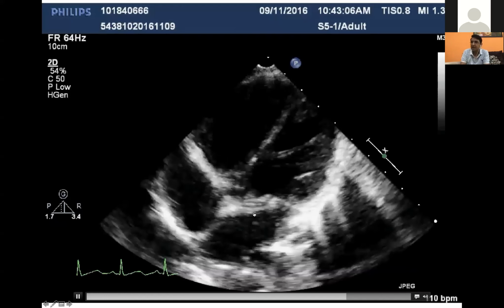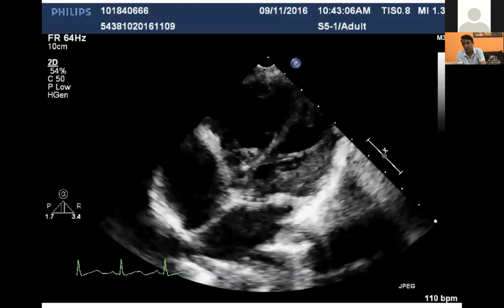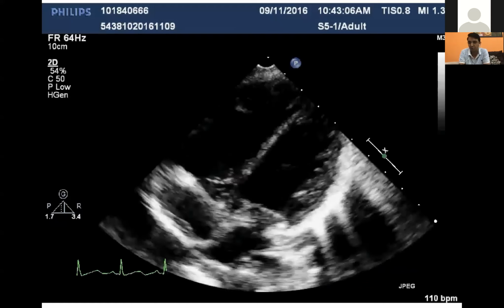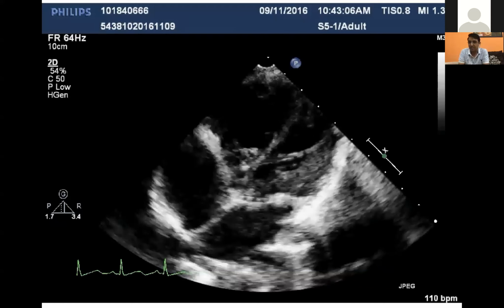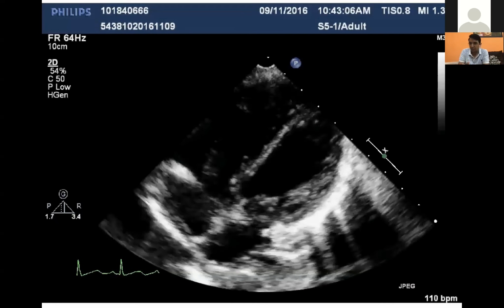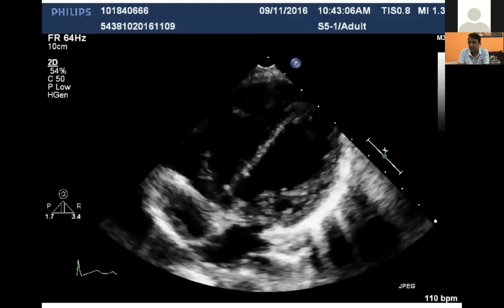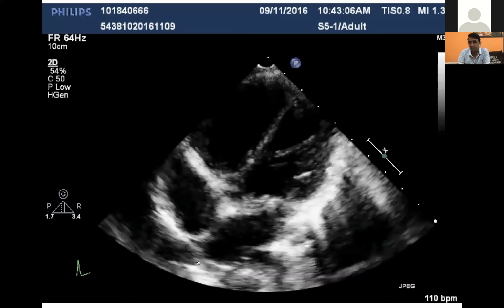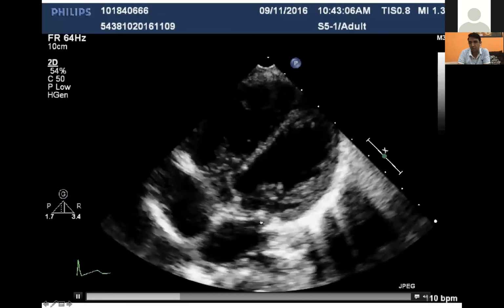And this is the relative contraindication to device closure in ASD, because there have been reports of coronary compression, except in those cases where there is a retroaortic rim which is more than 5 millimeters, which makes the device away from this circumflex and makes the chances of coronary compression much less. So we need to be aware, and this is such a simple way to assess this retroaortic coronary on transthoracic echo.